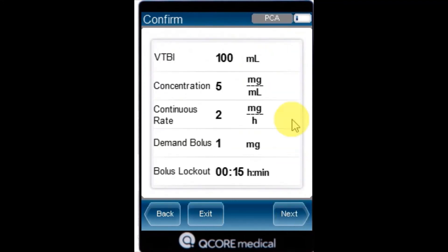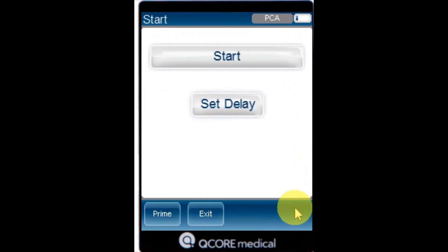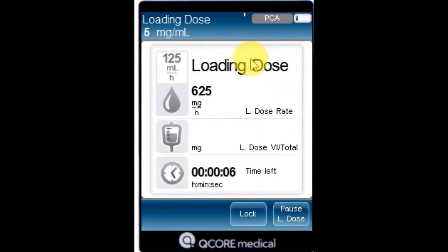Review the parameters displayed on the confirm screen, and then press OK. To begin the infusion, make sure that the clamps on the administration set are open, then press Start, and the running screen will appear and the infusion will begin.